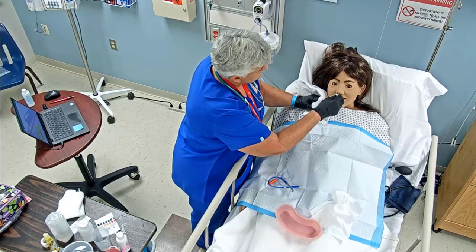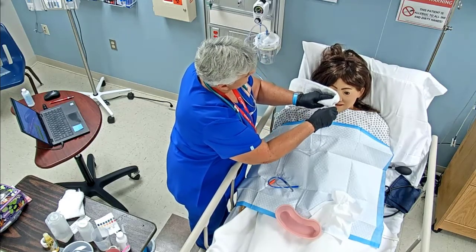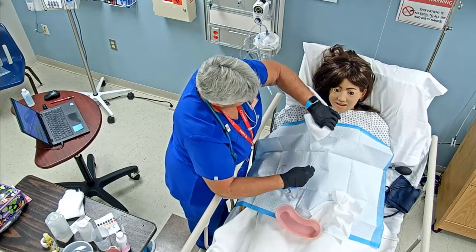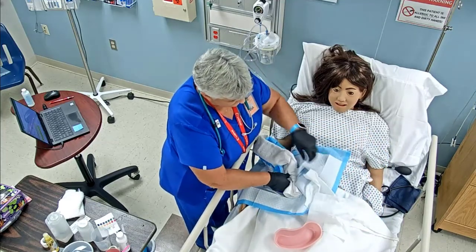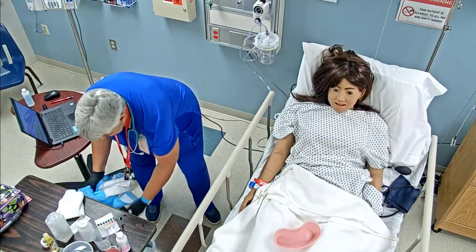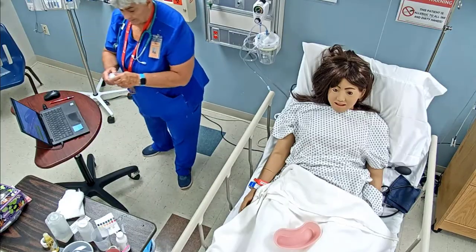Now what I need you to do is take a deep breath and hold it, okay? Take a deep breath, hold it, and I'm going to carefully pull this out. We're going to wrap it up down here. Here's your tissue to help with some of that lubricant that was on there. I'll get you some more tissue, and we're going to dispose of that. Glove to glove, skin to skin. I'm going to do my medical hand wash.